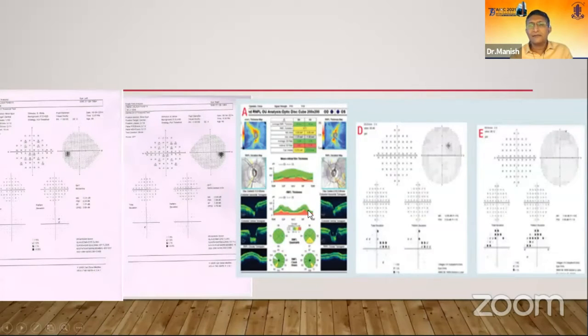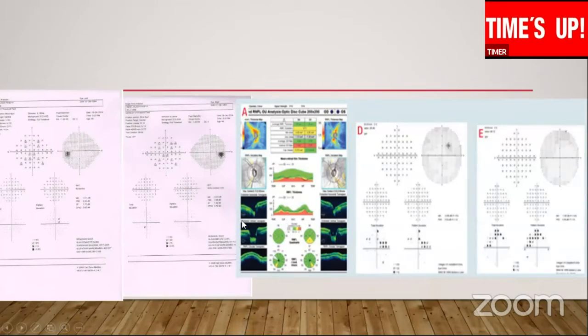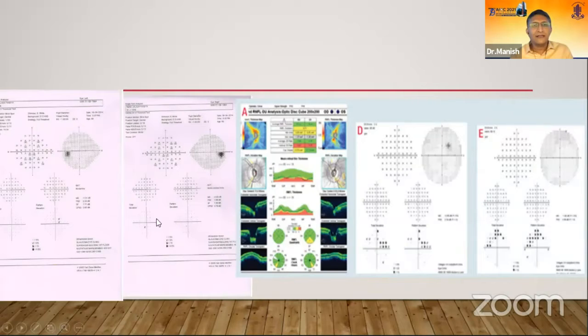So this is another example where you see the OCT is very, very borderline, but you are having a suspicion that the patient has glaucoma. And you do a 24-2 and see there are no points. But here it is important sometimes to do a central field, and there is increasing importance of doing central fields, even 10-2 fields, even in early glaucoma patients. And therefore, I prefer nowadays to do the 24-2C test with the SITA Faster in these kinds of early cases.